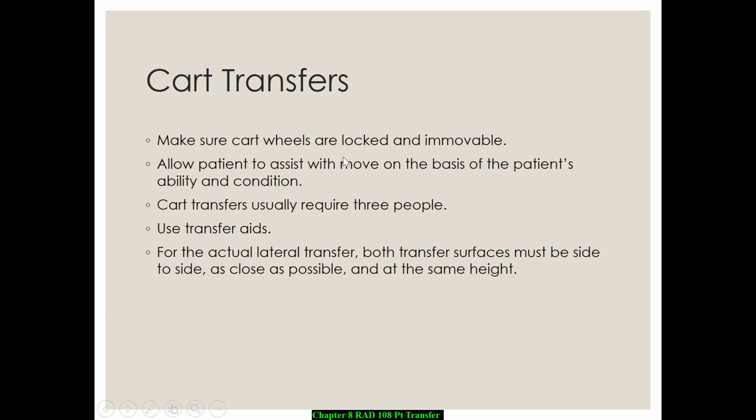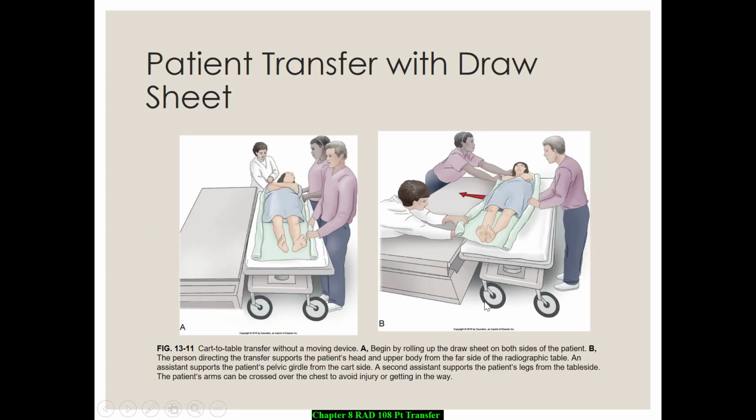Cart transfers, we started doing some work with the stretcher. Just keep in mind that your wheels are going to be locked in place. You make sure you've got the rail down when you bring it up against the table. I do recommend that you have a minimum of 3 people when you're doing your transfers, and you want to keep that side closest to the table and the table at the same height so that it's a nice even glide for your patient across the table on that stretcher.